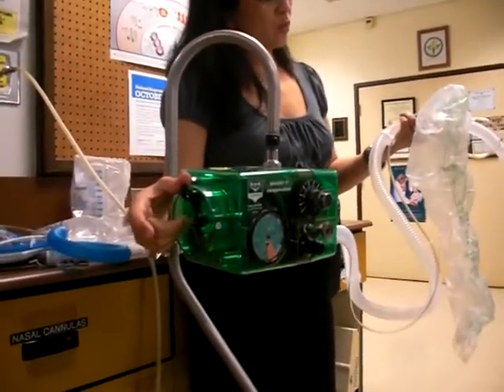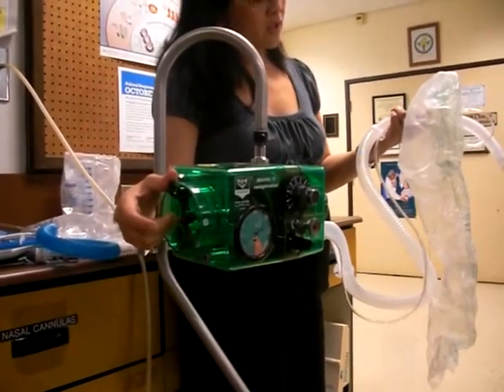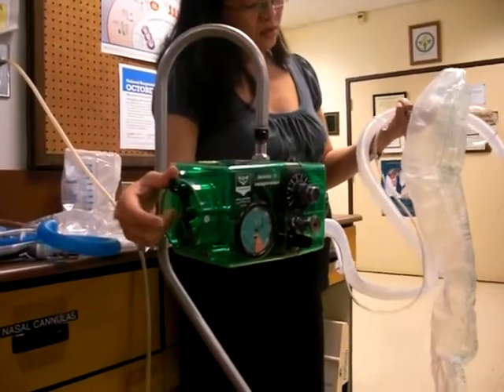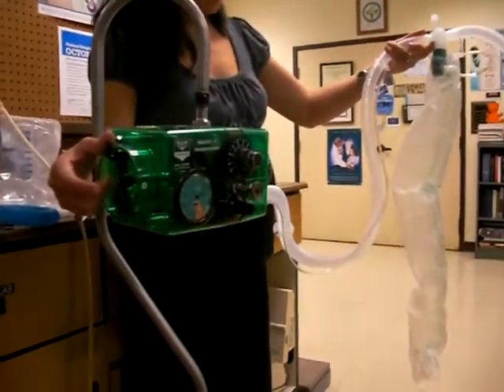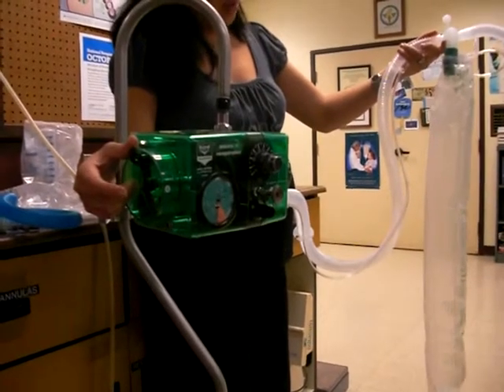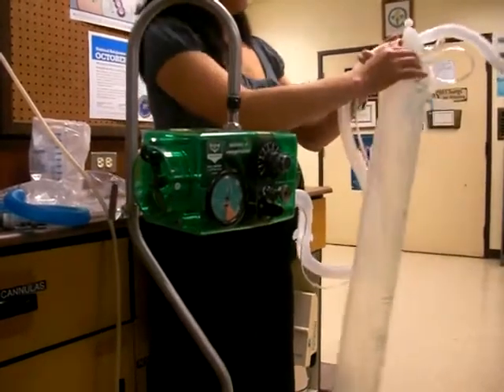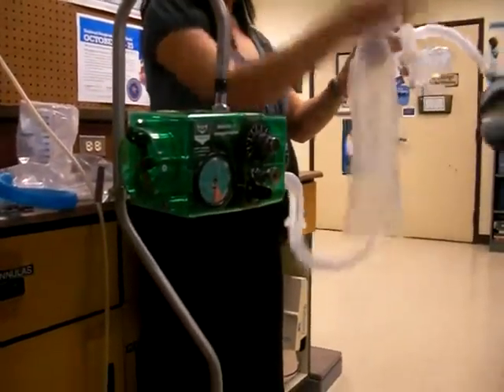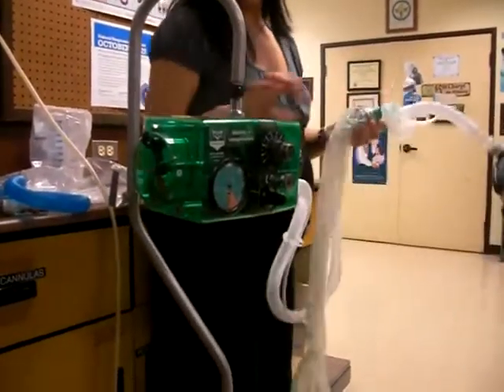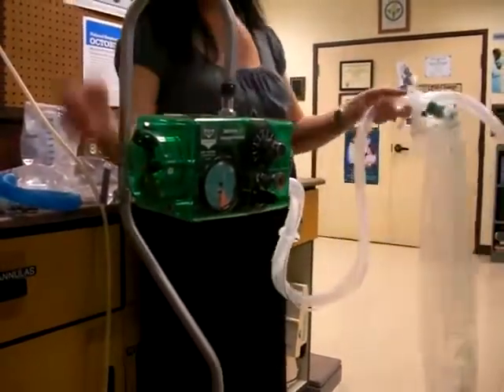2, 3, 4, 5, 6, 7. Oh, this actually works. 8. I think there's a leak in the bag. 9, 10. That's wrong. 11. It should be going up. 12. That's like 400. Okay, go up on the pressure again.